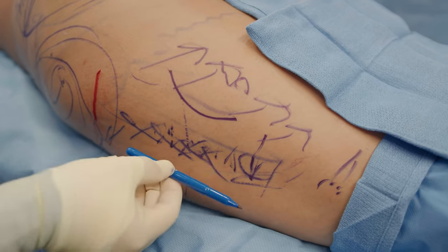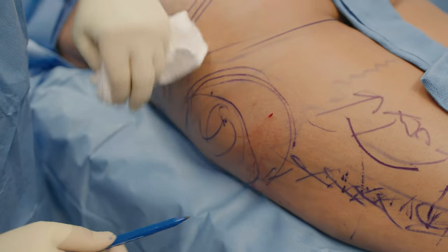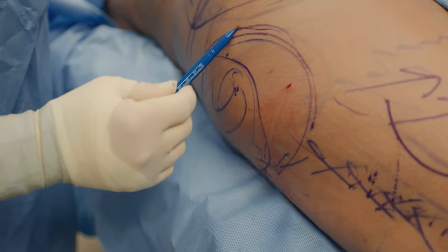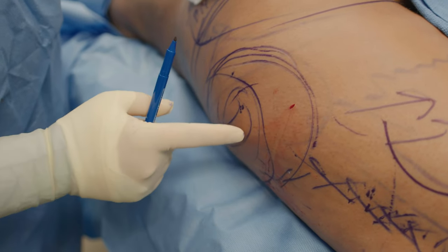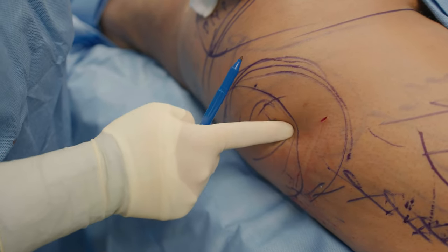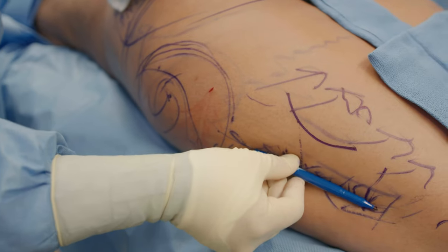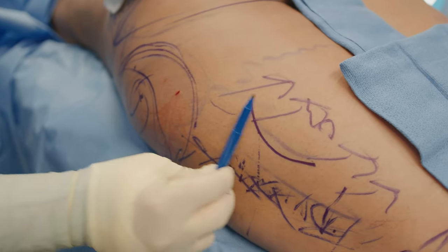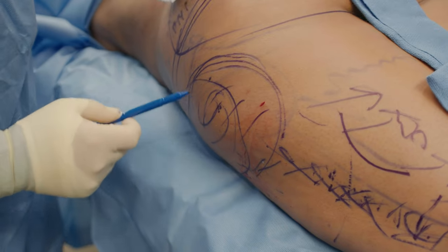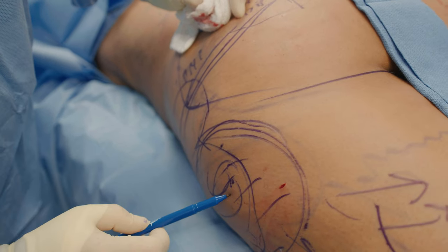So then this will be nice and smooth. I'm going to carry that into this area here where she's got a nice fatty collection. But there's a dip here — it's not nice and smooth — so I'm going to fill all that. I'm going to just gently touch and put a little bit of fat into this hip because this is a nice fatty area. It's going to take up fat really easily, so I don't want to go crazy putting too much fat in here and then struggle to put it in these areas that are a little bit tighter. So I'm going to build this up to try to get it to this level of where this fatty pocket is. Put a little bit in here and then I'm going to start working on this part of the hip here to even it and have it come out a little bit more.